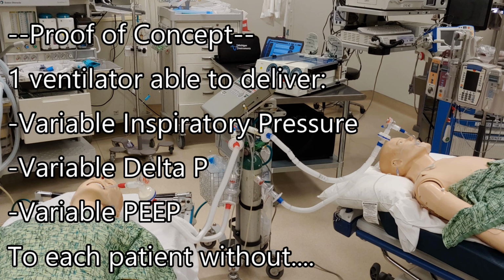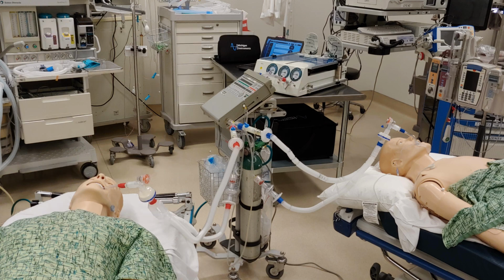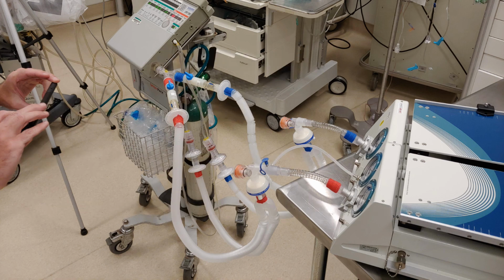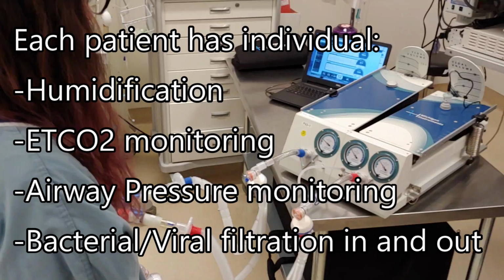It's that we have one ventilator able to deliver variable inspiratory pressures, delta P's, and PEEPs to each patient without having to worry about cross-contamination between patients, any pendelluft effect, any competitive exhalations which impair the exhalations of another patient, or disconnects affecting the other patient should we have to bag, swap equipment, deal with codes, anything like that. All the while, each patient has individual humidification needs met, end-tidal CO2 monitoring, airway pressure monitoring, and bacterial and viral filtration of the inhaled and exhaled gas.